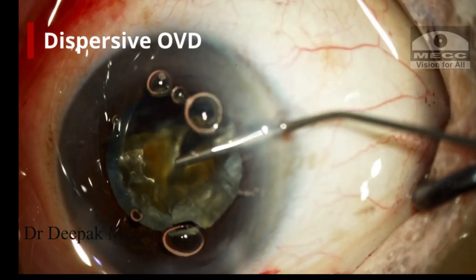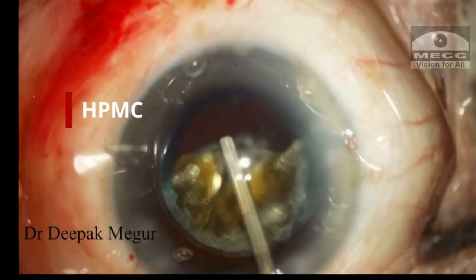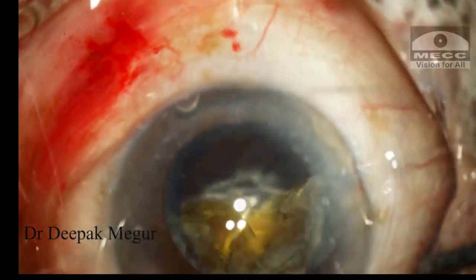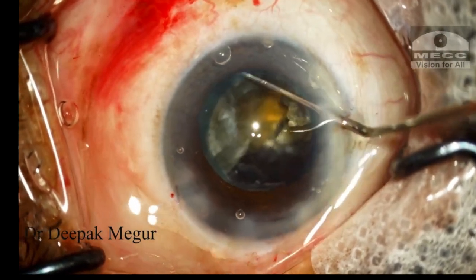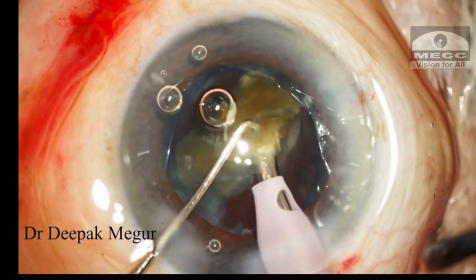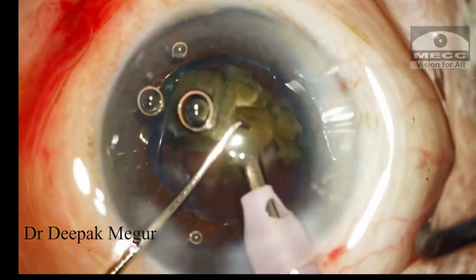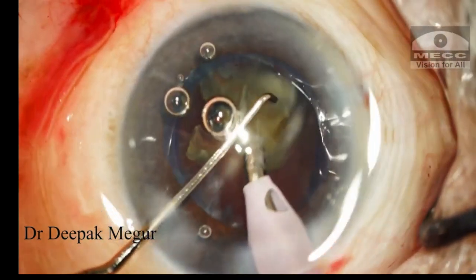So one prerequisite would be to use an adequate amount of appropriate OVD. I prefer to use the dispersive OVD on top, followed by HPMC underneath. It is some sort of a modified soft shell technique, if I may call it so. Dispersive OVDs like Viscoat, etc., can be thermogenic. That is, they can produce a lot of heat.